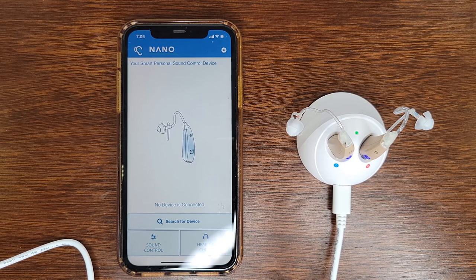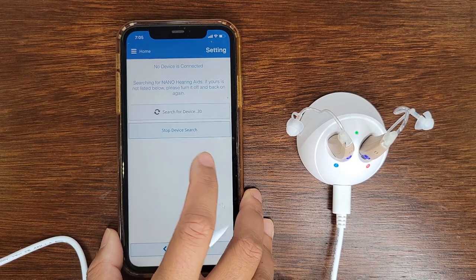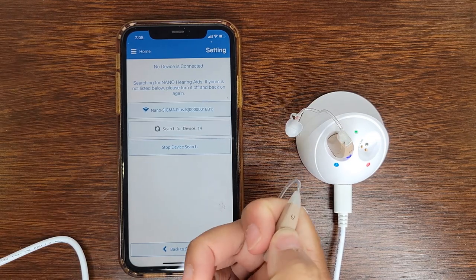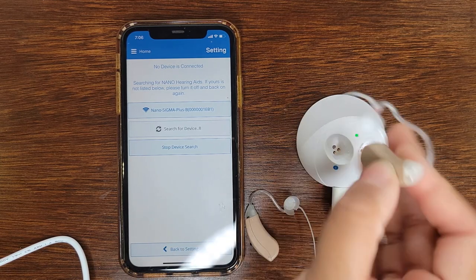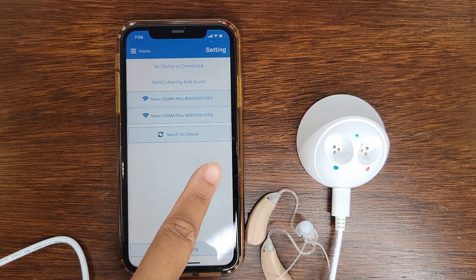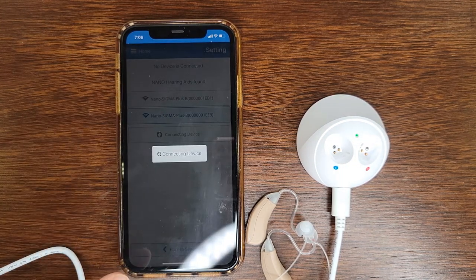So let's try to connect it. Let's see if it connects while it's plugged in. Now let's try, it seems like it's not, okay, so when I turned it on, alright, so you gotta make sure that you turn it on, and when you do that, you're gonna see both the right ear and the left ear pop up. So I'm gonna connect to both of them.